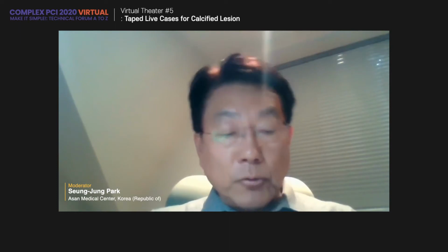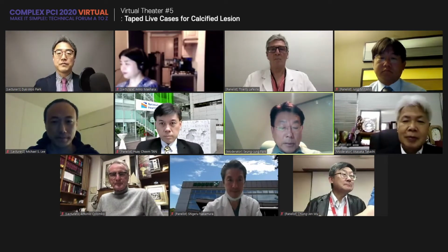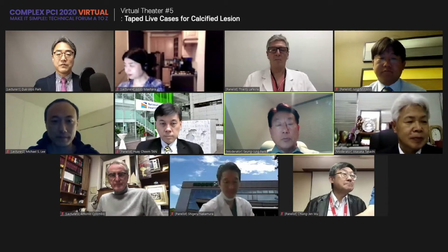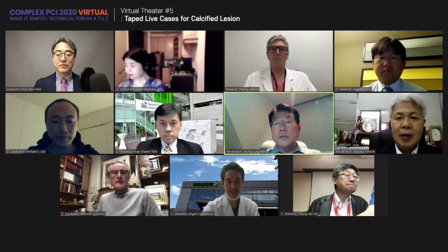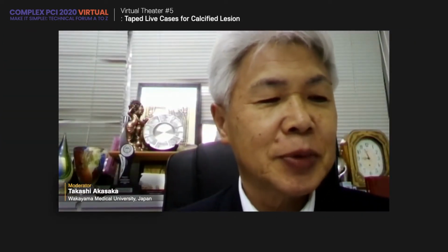So I'd like to introduce Takashi Akasaka, my co-moderator, and an excellent panel: Dr. Thierry, Dr. Shigeru Nakamura, and Dr. Wu, who actually joined together. Dr. Akasaka, would you introduce the first cases? Okay. We will have three cases, and I would like to introduce the first case presentation.